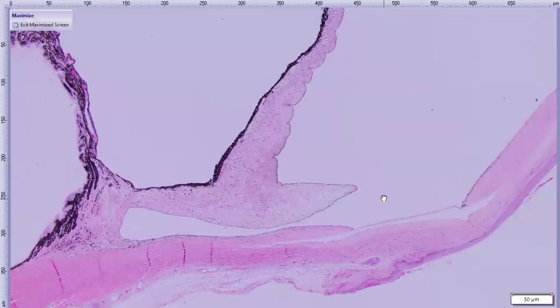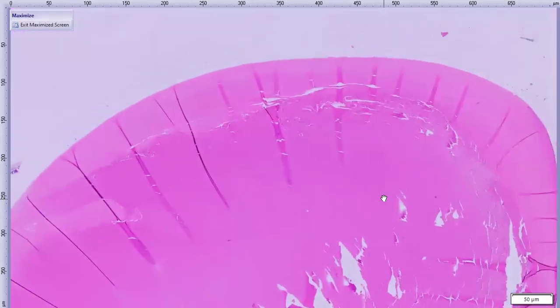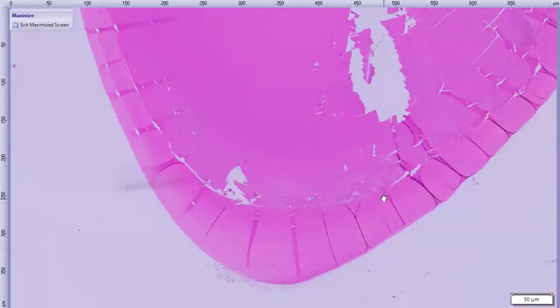And the cataract, did it look poorly formed, or did it look congenital, or just a straight up cataract? I think it looks like a straight up cataract. It just looks cortical to me. Features that might suggest congenital are disruption of the lens bow and often nuclear mineralization, more of a nuclear effect or a deep cortical effect. I don't think we can rule out congenital, but it looks like a conventional cataract.